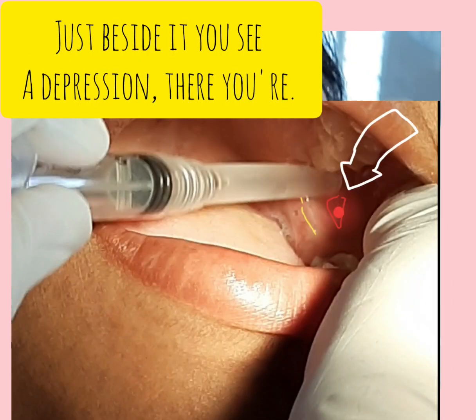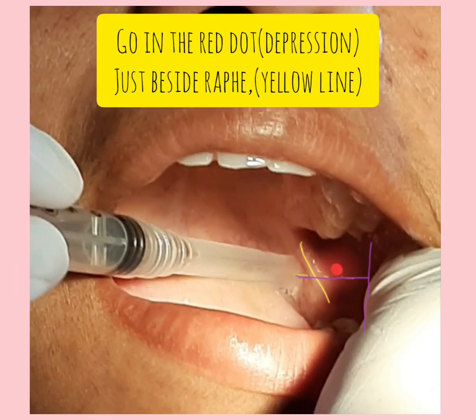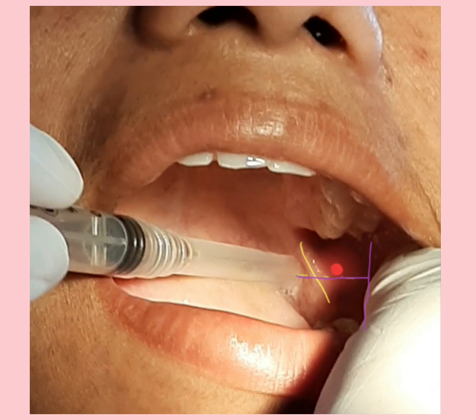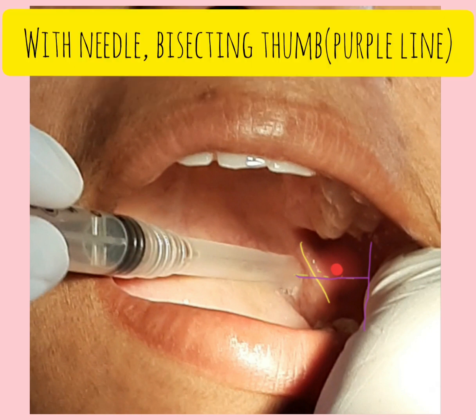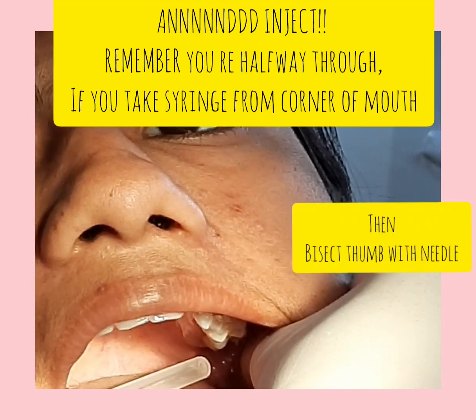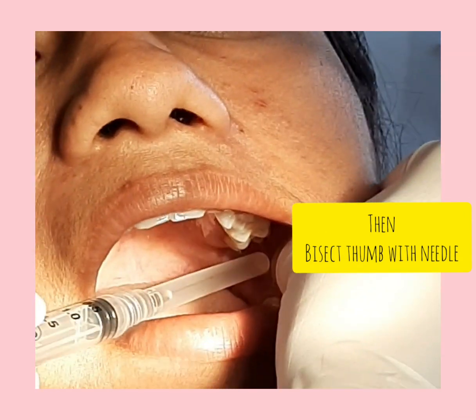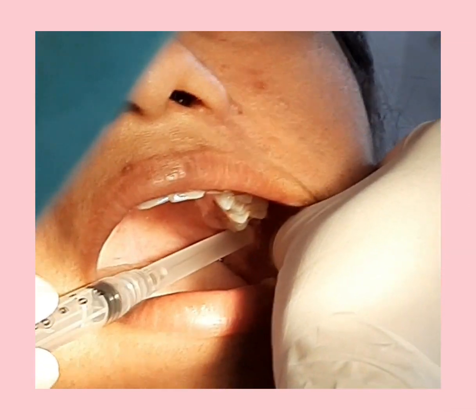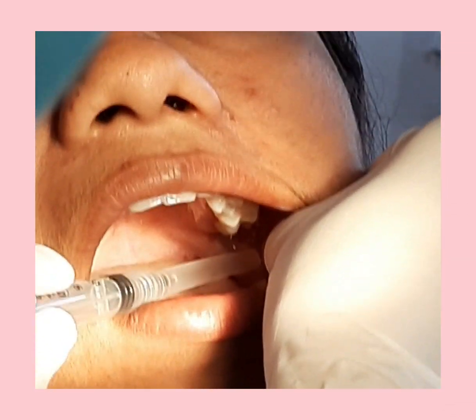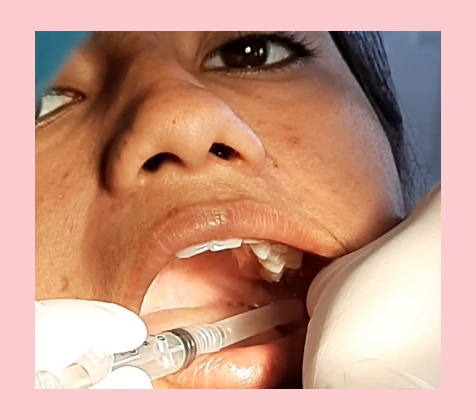Just beside the raphé, you have to insert into a depression you'll see there. Your needle should be perpendicular, or more precisely, it should bisect the fingernail or thumbnail. You can see it should bisect your thumbnail, and just beside the pterygo-mandibular raphé, you should insert it inside that depression.